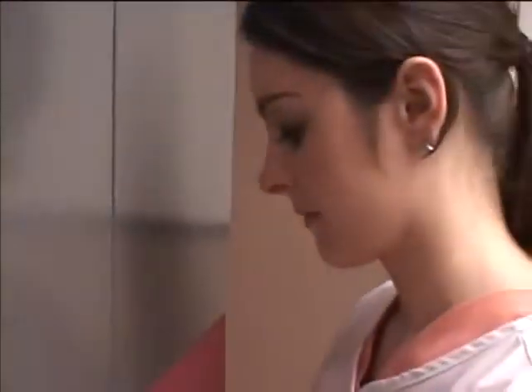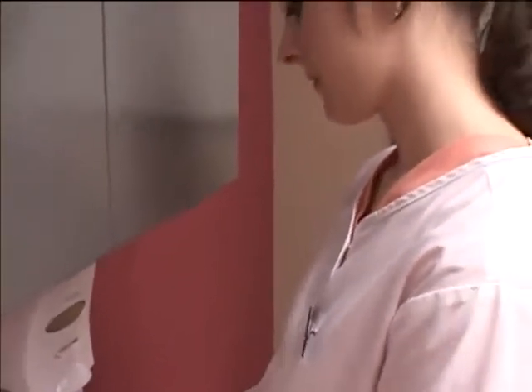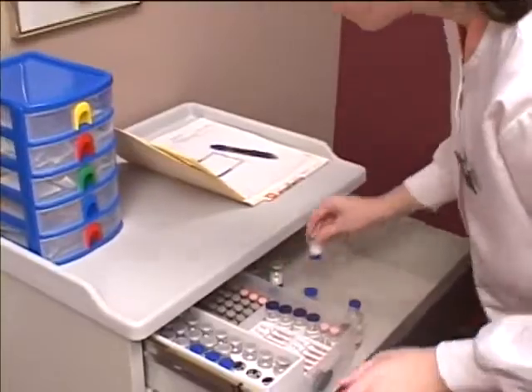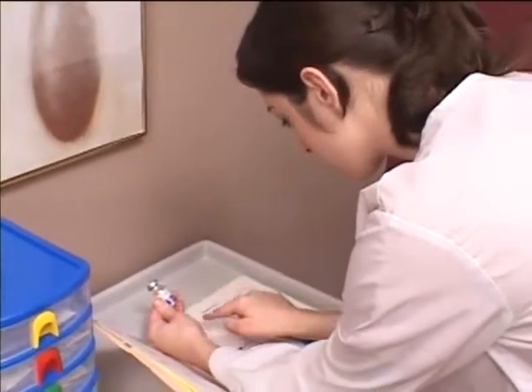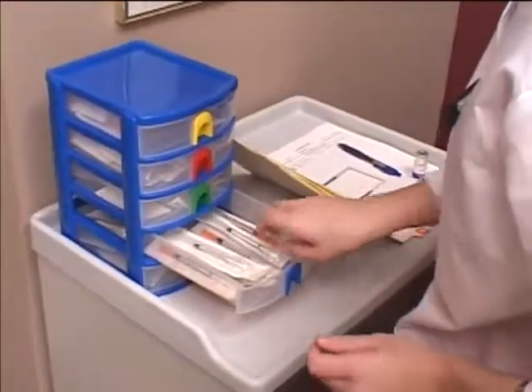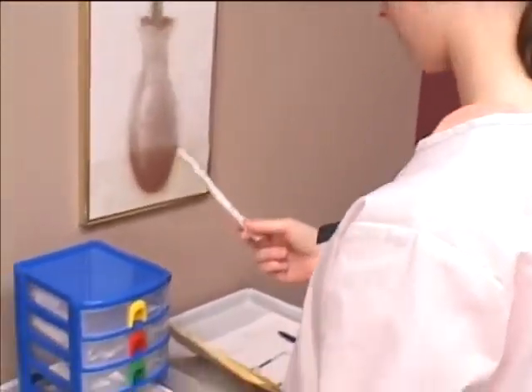Let's follow the medical assistant as she extracts medication into a syringe using several techniques. When ordered to withdraw medication from a vial for administration, you should begin by washing your hands. Next, select the appropriate vial of medication and prevent error by verifying it against the physician's order for the 6 rights. Select the appropriate syringe and the appropriate gauge and length needle.